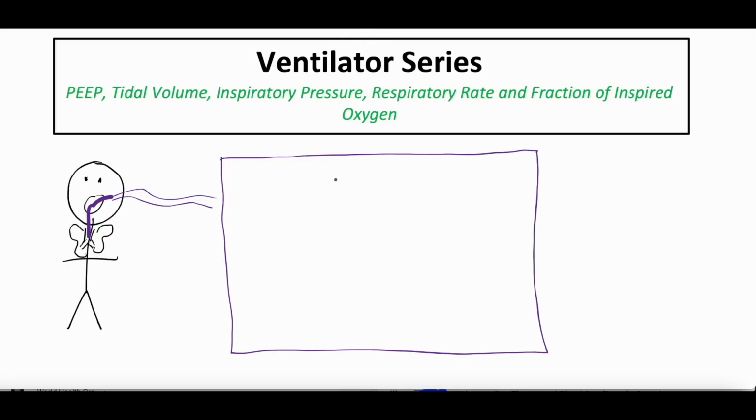And for this video, the settings are going to be for volume control or pressure control. We're not going to go into more advanced modes of mechanical ventilation such as SIMV or APRV or pressure support or what have you. This is going to be for volume control and pressure control, specifically volume control, assist pressure control.